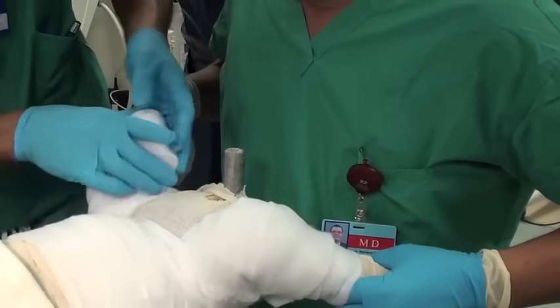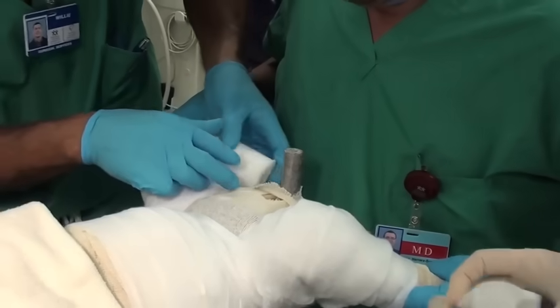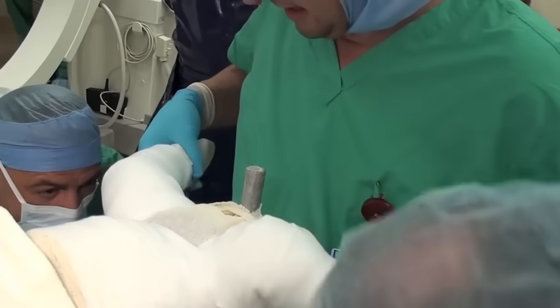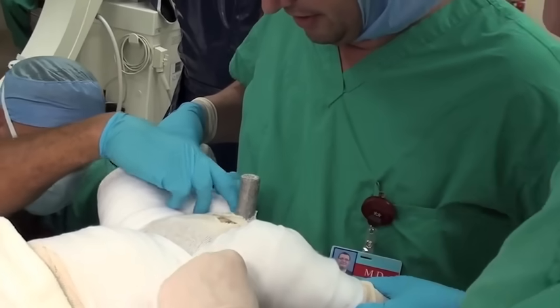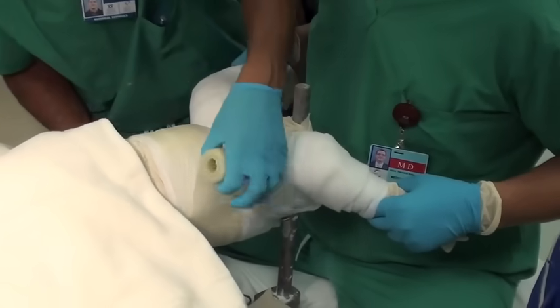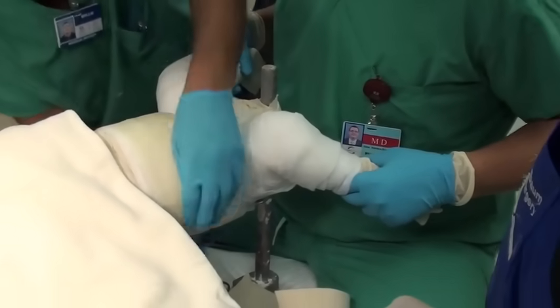You can see the doctor is holding the hips in a reduced position. The legs are padded as well. Cast technicians help with this part of the process.